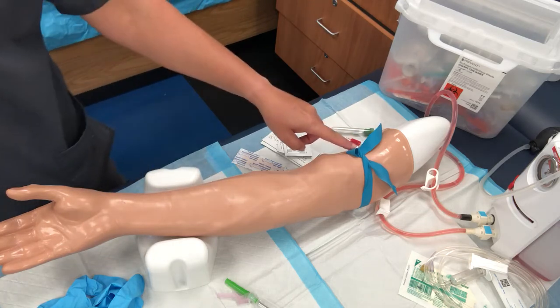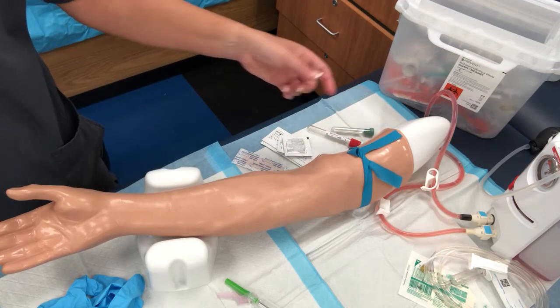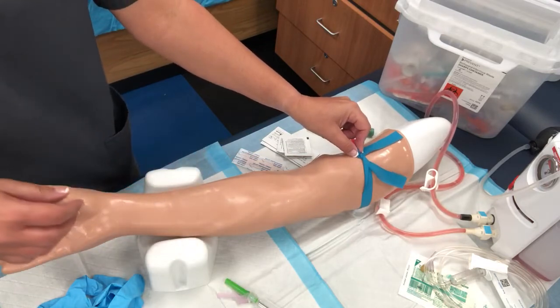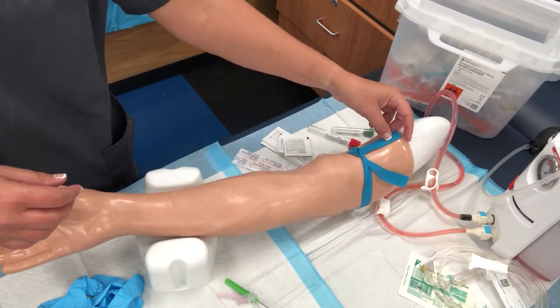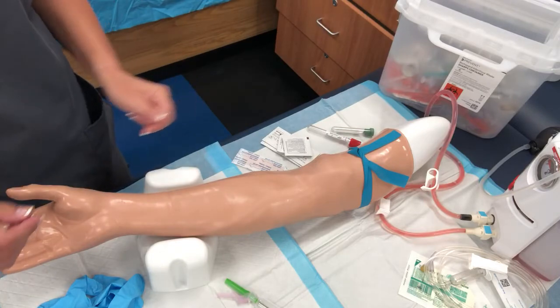Now, the nice thing is when you're done with this, you simply have to pull this tab, which you can do with one hand. And because you haven't pulled it through and tied a knot, number one, you have better resistance here. Number two, in terms of causing this vein to engorge and bulk up, it just becomes easy to pull this tab and kind of pop it, tourniquet comes off.